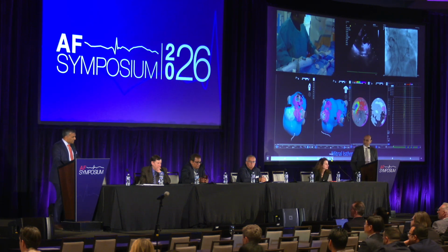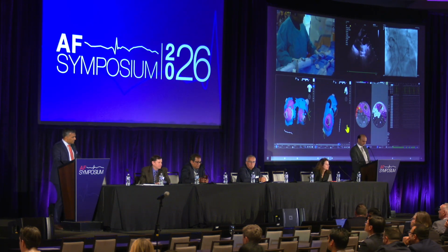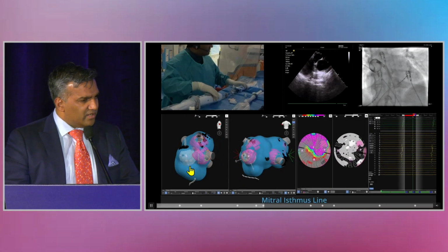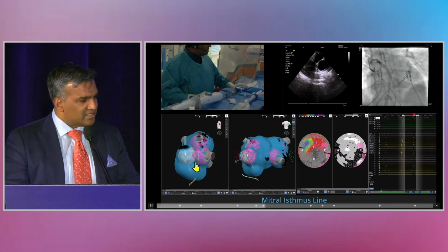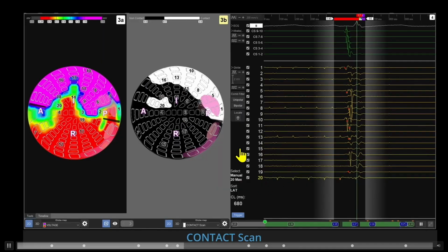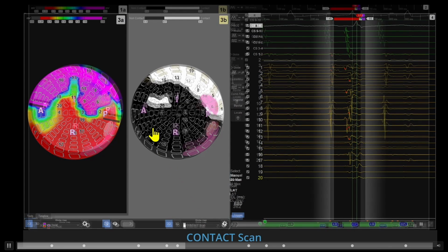Okay, so let's just do this. This is the first interesting thing. So this patient, we're going to do a mitral isthmus line here. So if you look on this view here, left lateral view, these are the PVI lesion sets. We're positioning it here at the mitral annular region. And then what we can do is we're running a contact scan here.